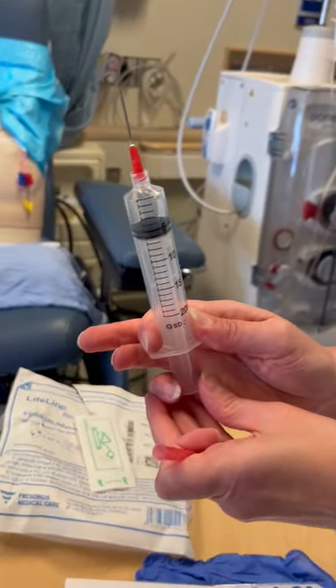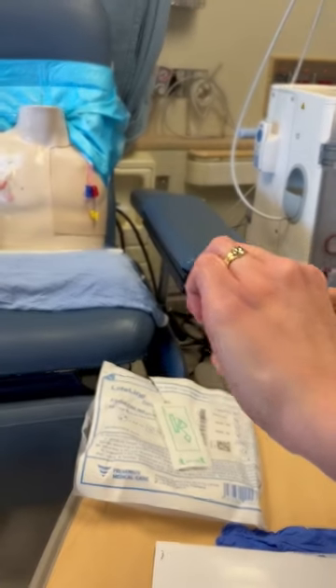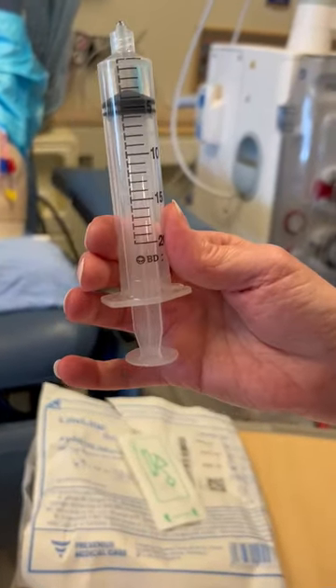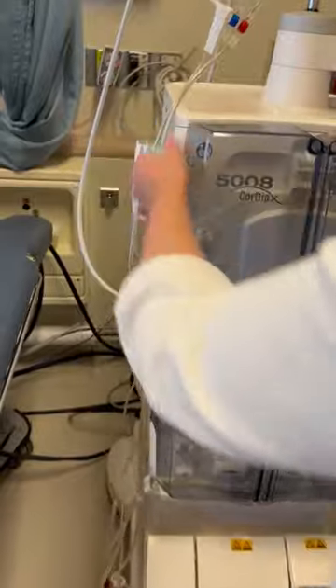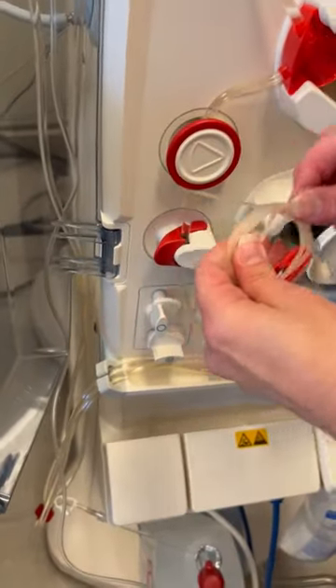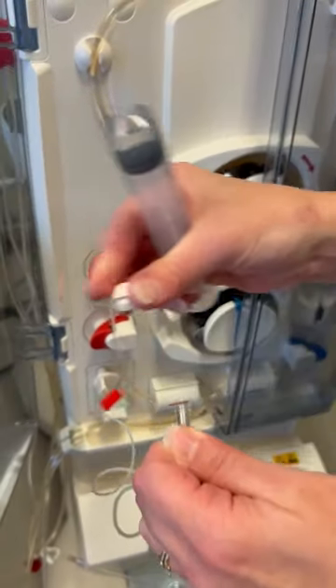Let's get out any air that is left in the syringe. Now we have the prescribed dosage. Next we're going to open our doors. Leaving the heparin line clamped, we're going to attach our syringe to the heparin line.